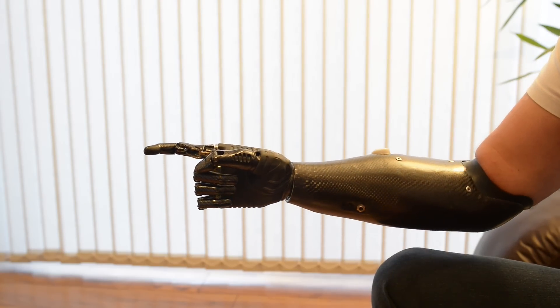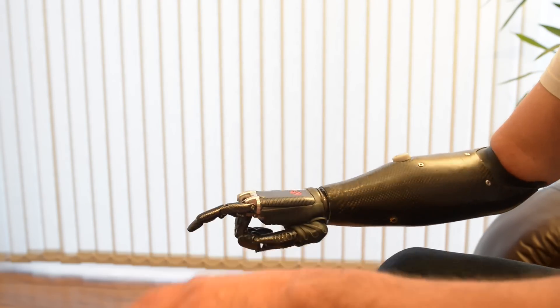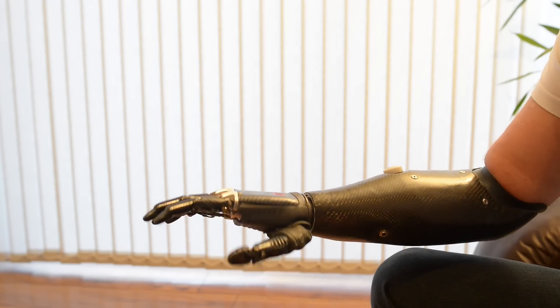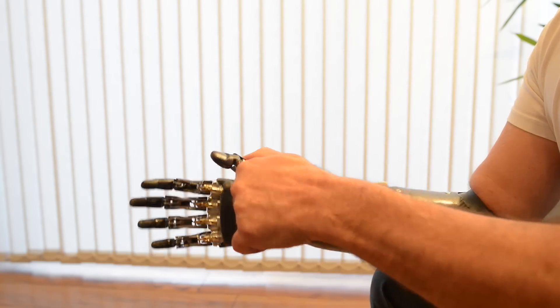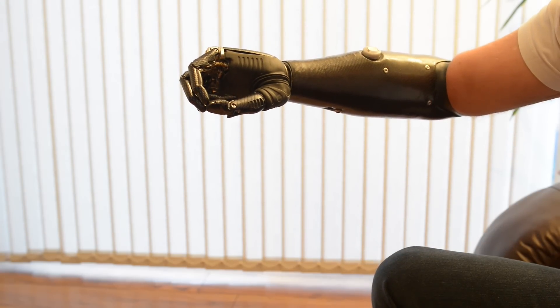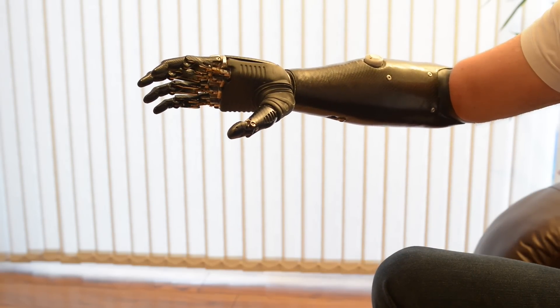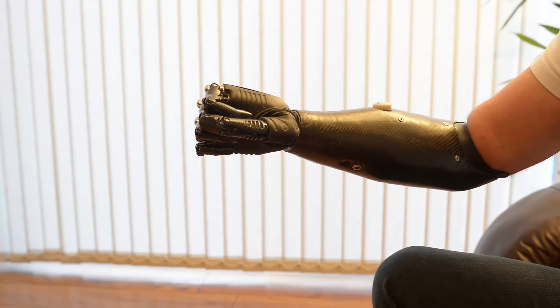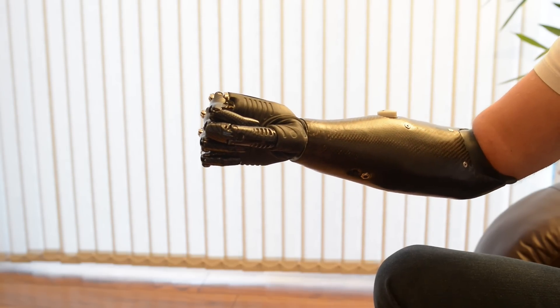This one will allow me to type on the keyboard. We then move the thumb to this position and we can get a tripod grip, so picking up small things. We can then change the grip again. This is power grip. This is for heavy things. This is for shaking hands. This is for being human.